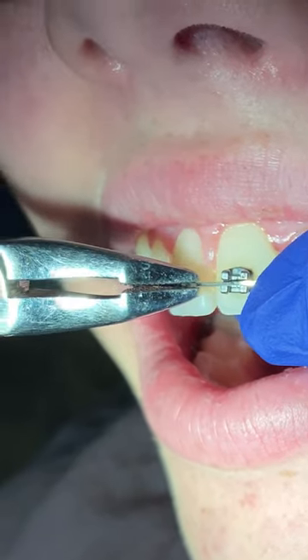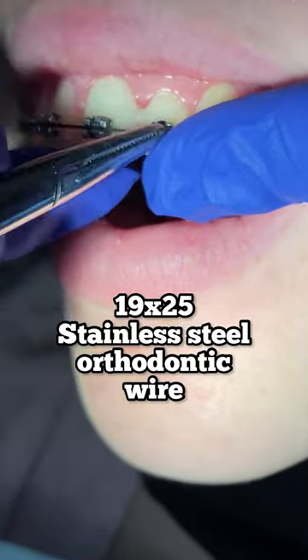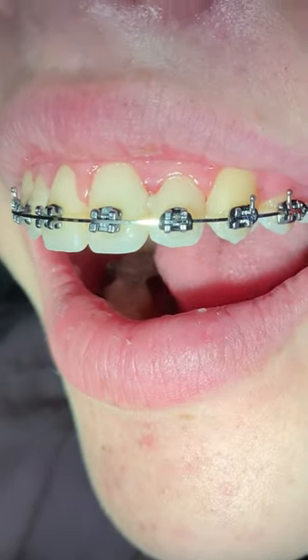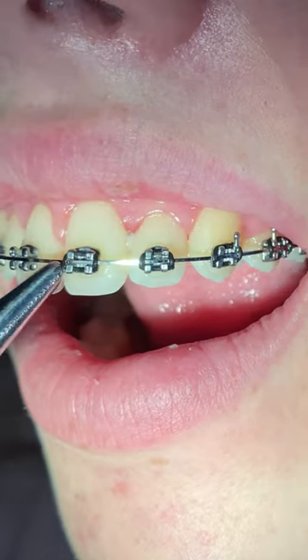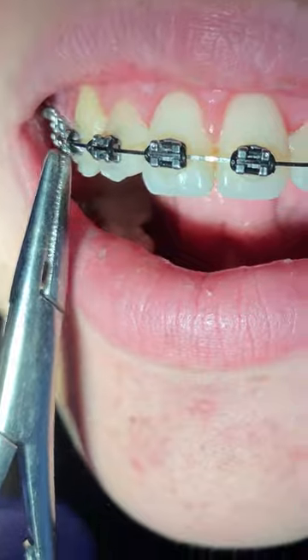Now what we're going to do is place a 19 by 25 wire upper and lower in stainless steel, so it's not heat activated. This is going to help with your bite — you'll probably use some rubber bands during the treatment as well.